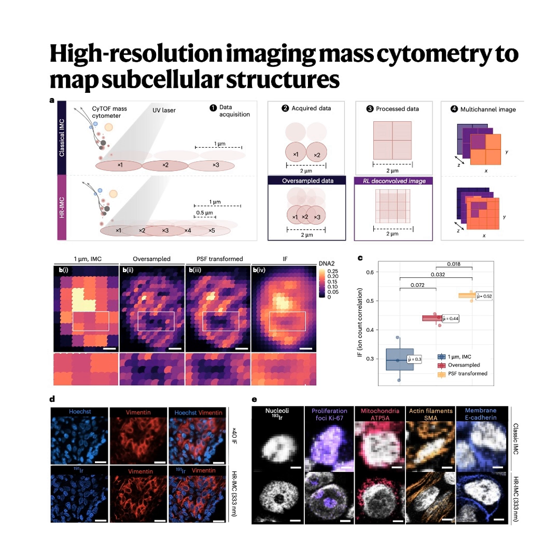They did. They identified hypoxic tumor cells, so cells starving for oxygen, marked by CAIX expression, and those specific cells showed a corresponding reduced mitochondrial content and a simultaneous increased expression of GLUT1, a glucose transporter. Which is the classic metabolic shift. It's the classic shift where cancer cells move away from oxygen-dependent energy production in the mitochondria toward glucose fermentation. Seeing that shift, the morphological change in the organelles and the corresponding change in transport expression mapped onto specific hypoxic regions within the native tissue is just revolutionary.